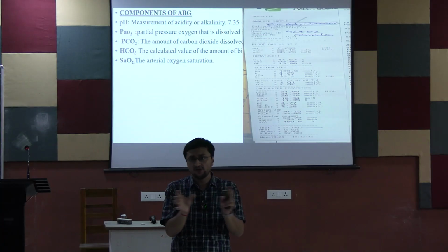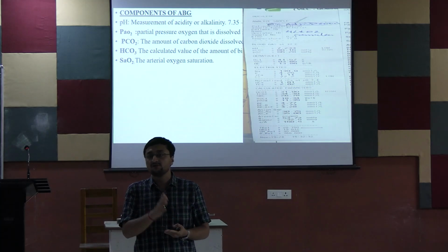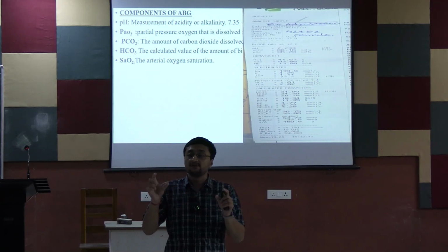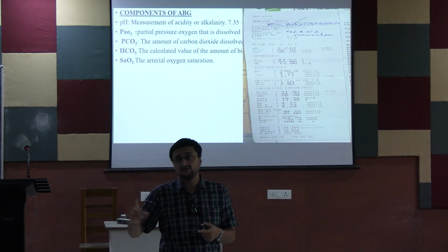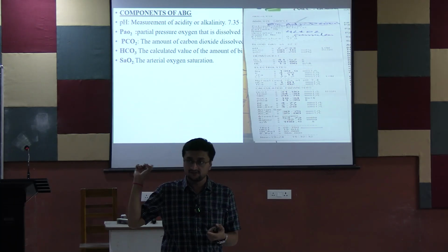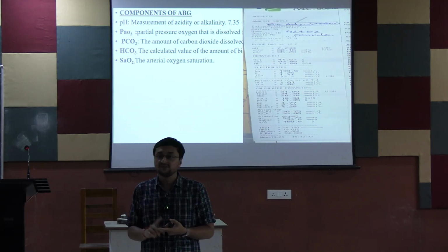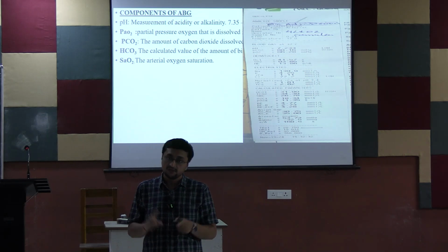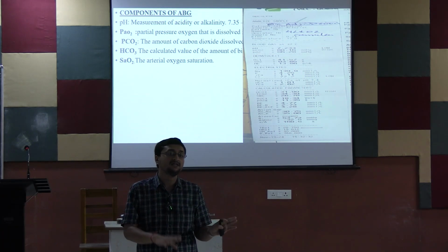That means quite similar, a gap of 3 to 5. That means yes, you are correctly doing an ABG. But if the SpO2 is showing 95 and your SaO2 is showing 64, that means this is venous blood, not the arterial one. Clearly understood? এখান থেকে বোঝা যায় যে কিভাবে arterial and venous blood কে differentiate করা যায়.